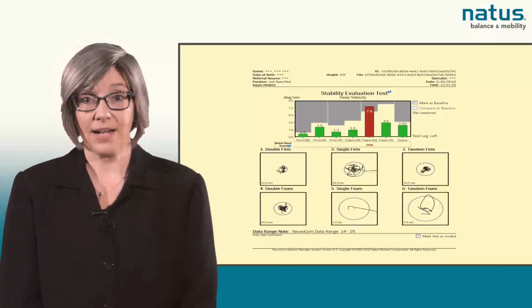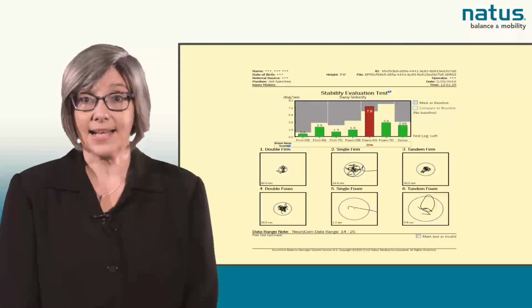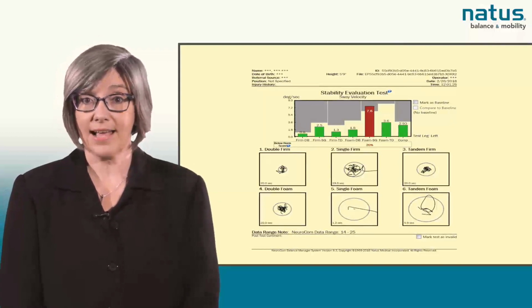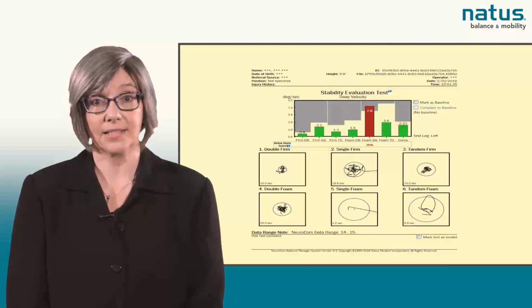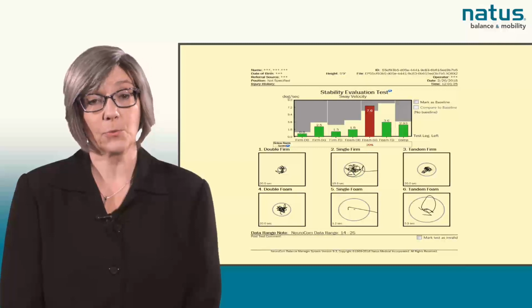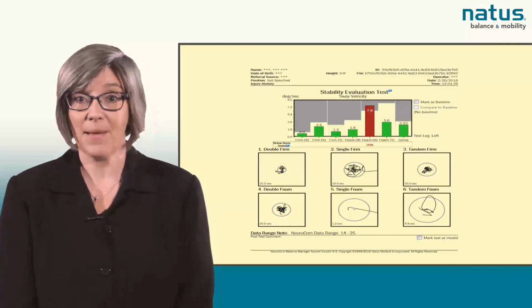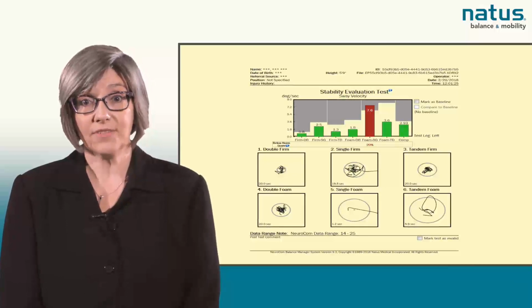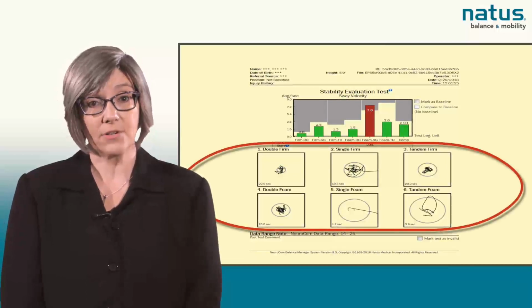The information provided by the SET protocol is designed to help the clinician assess the need for further testing in patients with signs and/or symptoms related to balance dysfunction, and also to establish objective baselines for preseason concussion screening, medical management, and outcome management. The results of the SET protocol are presented in graphical form.